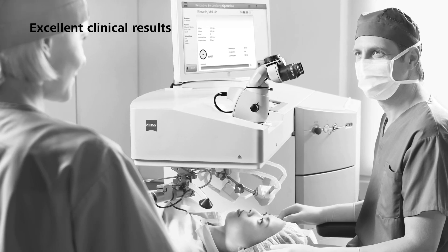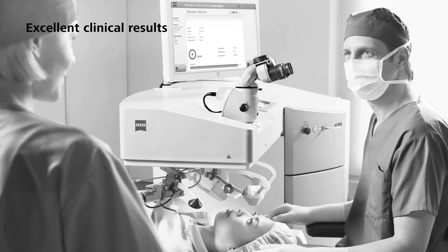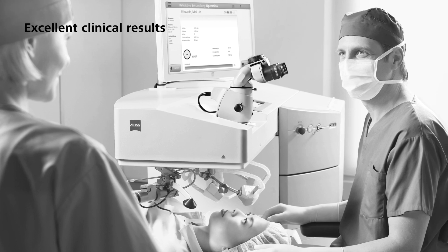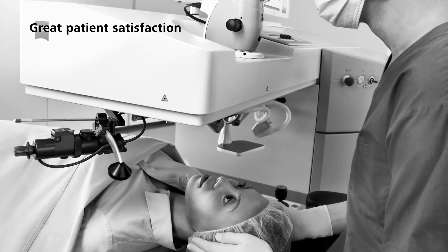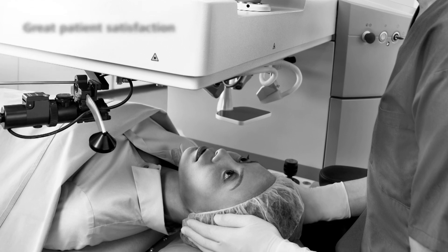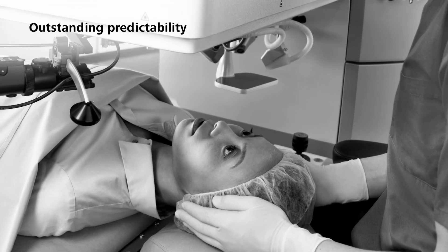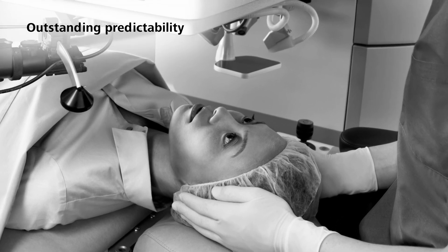Excellent clinical results will fascinate you and your patients. Great patient satisfaction. Outstanding predictability.